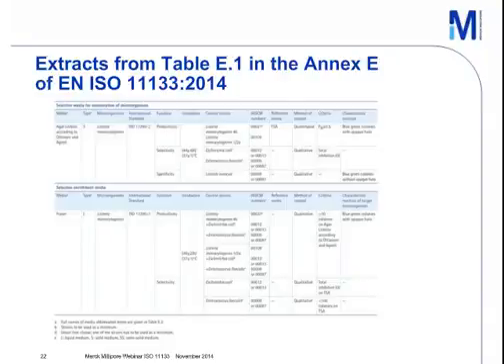All this is described in big annexes E and F. For example, here you have the table E for the food media. In the first part of this table you see the specifications for agar Listeria according to Ottaviani and Agosti. In our example, the specific microorganism is Listeria monocytogenes, which is also tested for productivity. For selectivity, E. coli, Escherichia coli and Enterococcus faecalis are tested, and for specificity, Listeria innocua is tested.